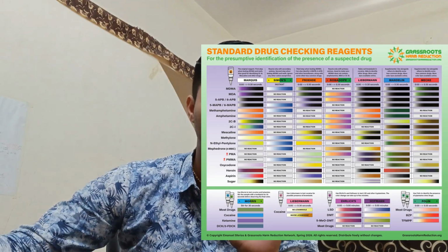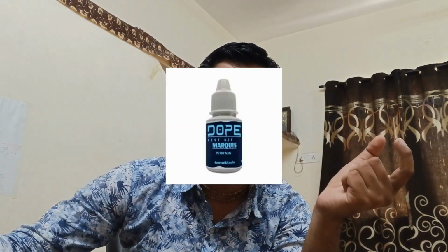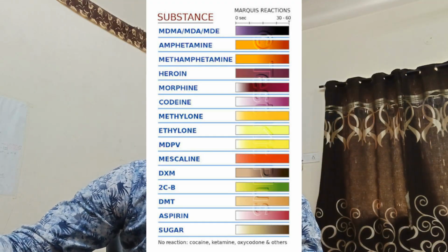So whenever our law enforcement agencies encounter a suspicious substance, which may be a controlled drug, they need a rapid preliminary indication of what they might be dealing with. So that's where spot testing comes in. Instead of waiting only for laboratory analysis, a presumptive chemical test is performed at or near the scene itself, right? For example, we use a reagent such as Marquis reagent, which can produce characteristic color reactions with certain classes of substance.